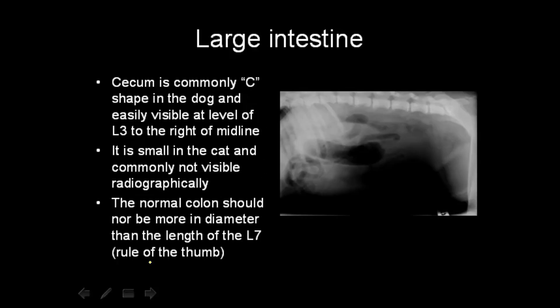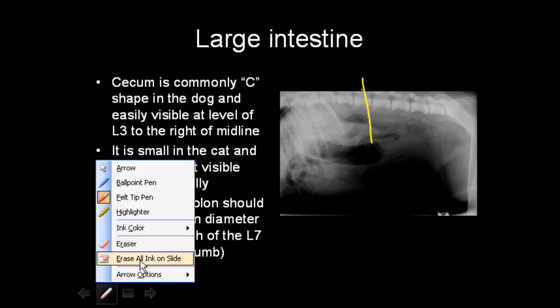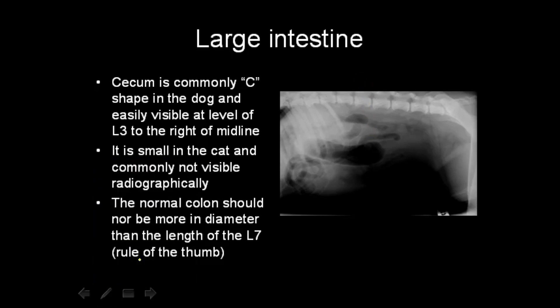The large intestine: the cecum is C-shaped and usually seen at the level of about L3. It is small in cats and commonly not visible radiographically. The normal descending colon diameter should not exceed the length of L7. If in doubt, that measurement is a useful rule of thumb.